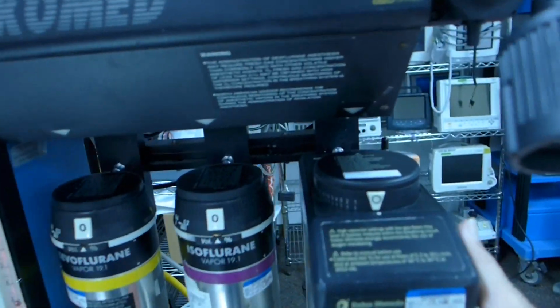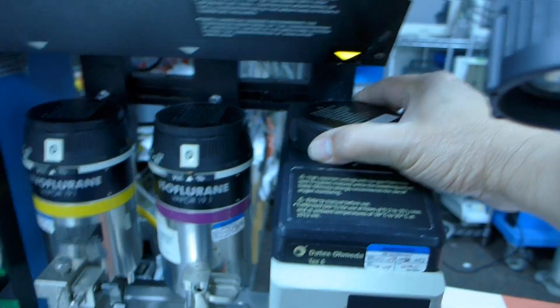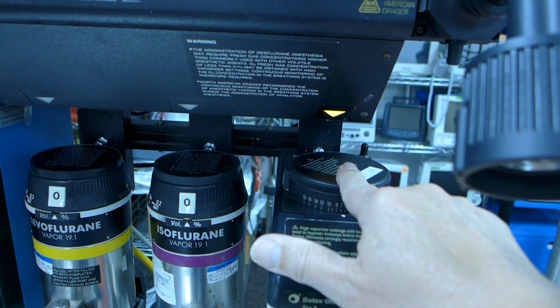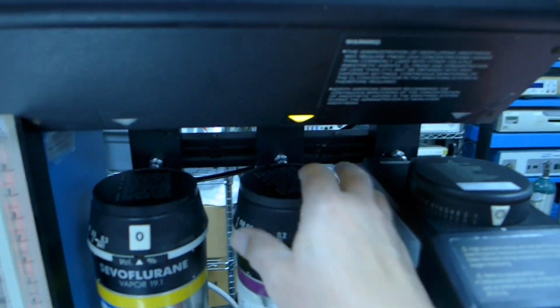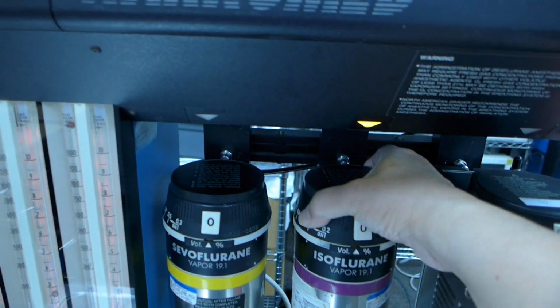So I can feel this is pretty warm. When you turn it on, this light tells us that the vaporizer has been turned on. And this one, let me see if I can turn this on. Again, this one is on, and it has that indicator.